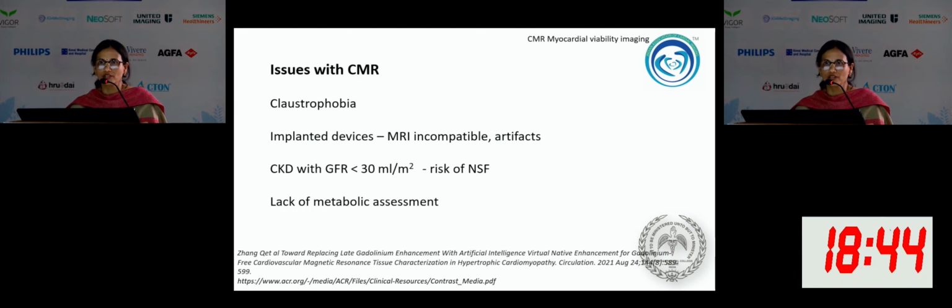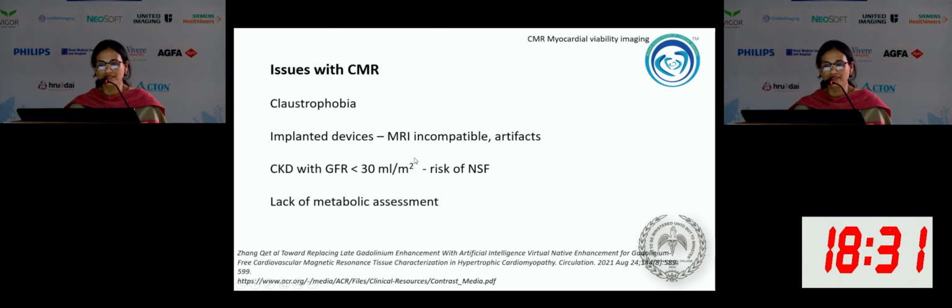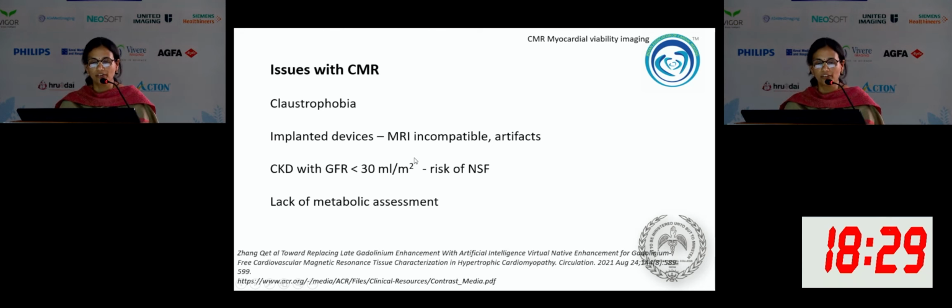So what are some of the issues with cardiac MR? We know there is claustrophobia. Some patients are not able to lie down. How do we do imaging in implantable devices? Sometimes there may be incompatible devices. And the artifacts, even if they are compatible, what about the artifacts? And what about renal failure? And the main thing, as Sir said, there's no metabolic assessment, only anatomic assessment.